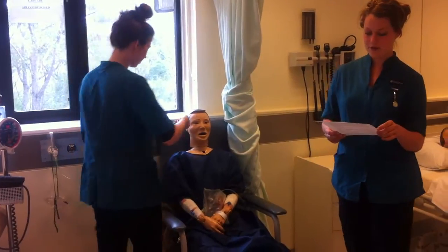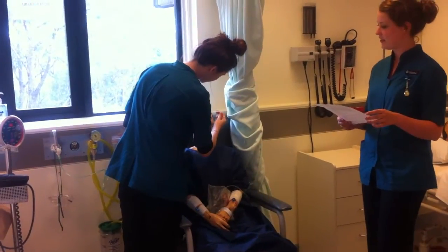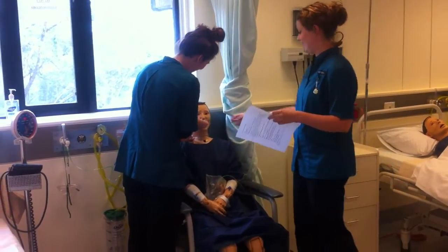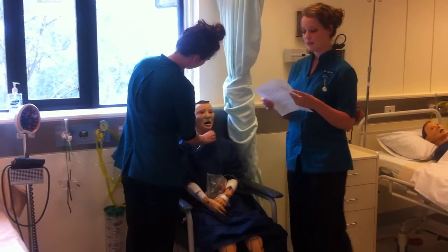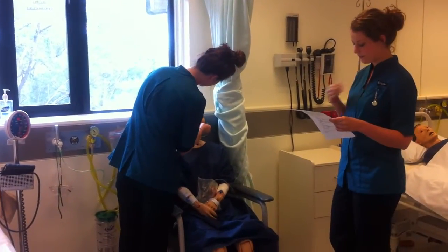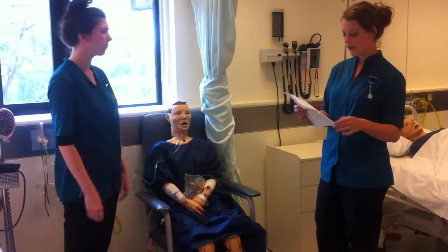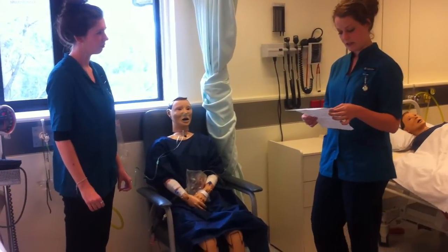Nasal prongs are a low flow delivery system consisting of a plastic tube that extends across the face with short projections curving into the nostrils. So we tuck them behind the ears. Nasal prongs deliver 2 to 6 litres per minute depending on the patient's breathing patterns. They are inexpensive, comfortable and well tolerated as the patient is able to eat, drink and talk. This is particularly useful in Mr. Saunders' case as he has bouts of vomiting due to the ulcer.